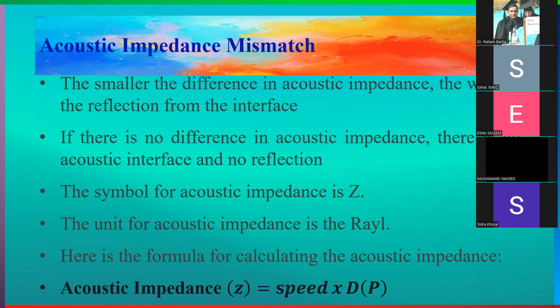That's why, according to speed of sound, different media are categorized into different categories like fast medium, slow medium, and average medium. Different media have different speeds of sound, and that speed of sound remains constant in that medium, irrespective of the frequency and amplitude of the sound wave.